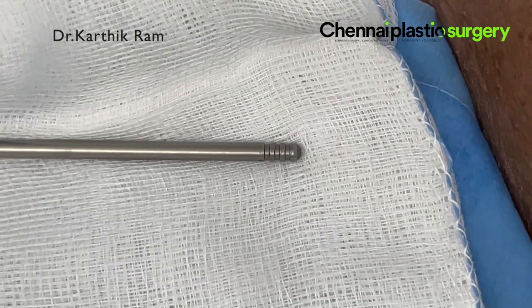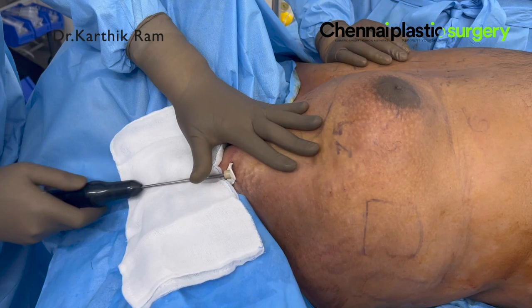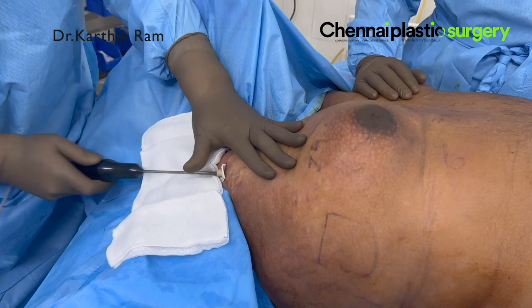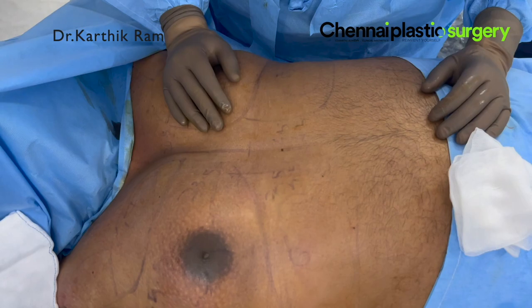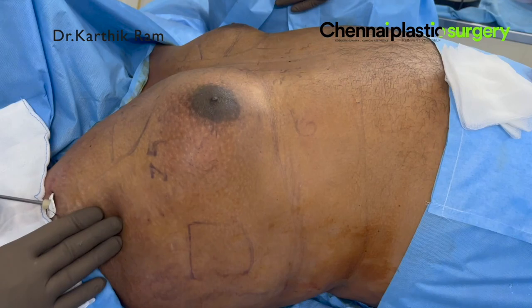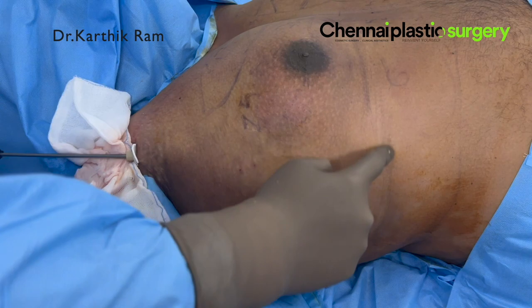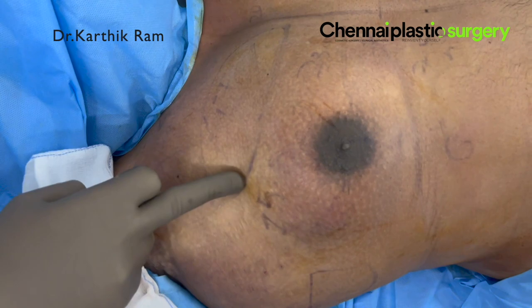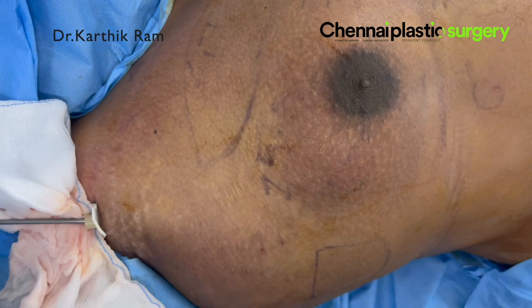This is the VASER tip. We use 3-groove probes so that skin retraction will be much better. Initially when you start the VASER, it has to be done superficially first and then deep. Most people ask why — it is because when you finish vaserizing the superficial area, when you go to the deeper area, only then the sound waves will be heard clearly, so we know we are doing VASER correctly. Finish the superficial area first, then that area will be a little loose, and when going deep the sound waves will be heard clearly. Do the sides completely — superficial as well as deep. In the gland area, VASER doesn't work much, so don't waste time in the glandular area.